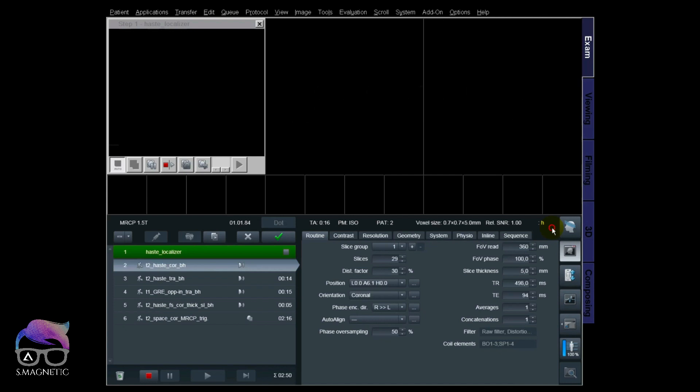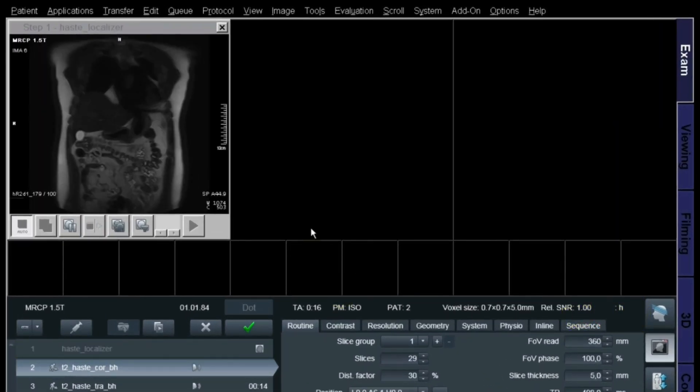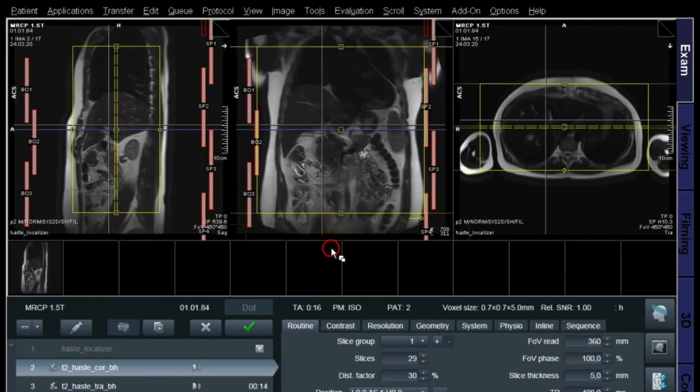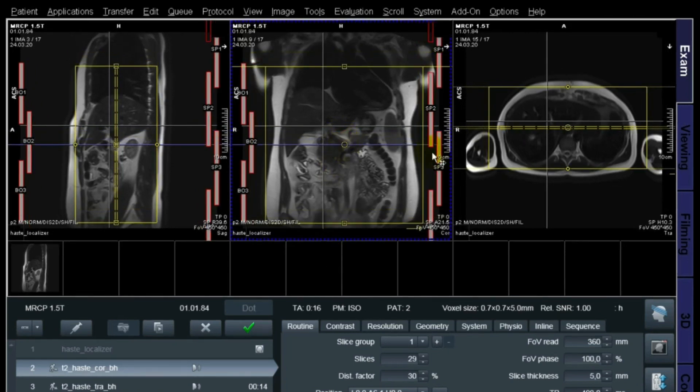We're starting out with a localizer — a three-plane localizer giving all planes: transversal, coronal, and sagittal. This localizer is free breathing. The first sequence is a HASTE coronal as a breath hold, because this gives me the ability to see the top and bottom of the liver. I position it like that in the coronal plane.